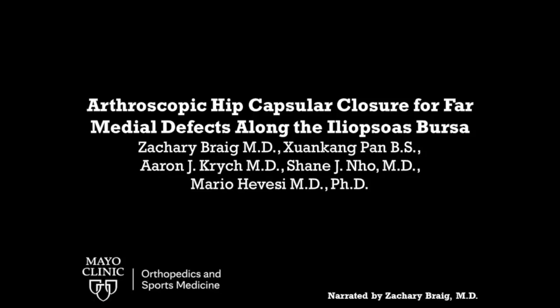The following is a video demonstrating an effective method for arthroscopic management of far medial hip capsular defects that consistently allows for reproducible capsular repair even in the absence of proximal capsular tissue.